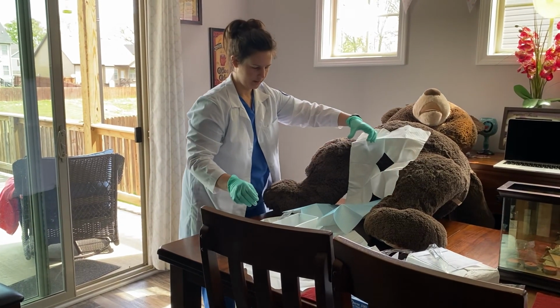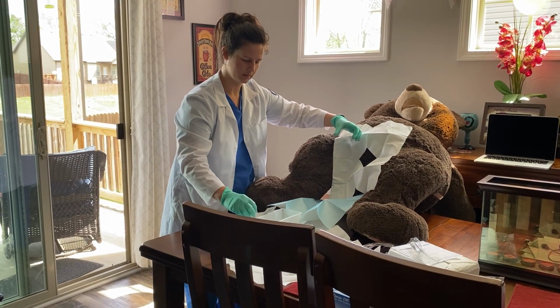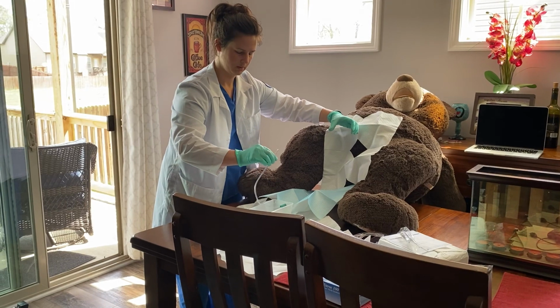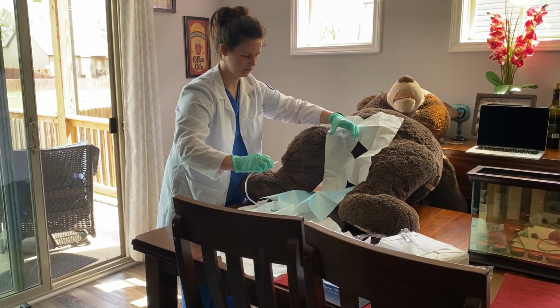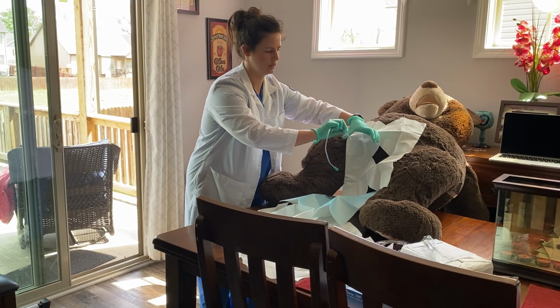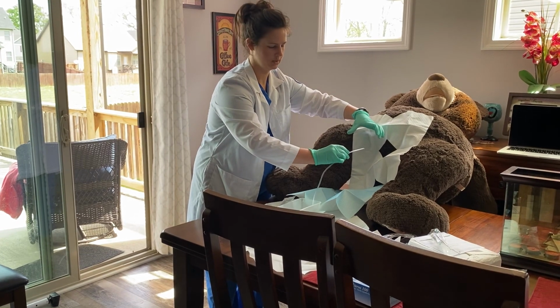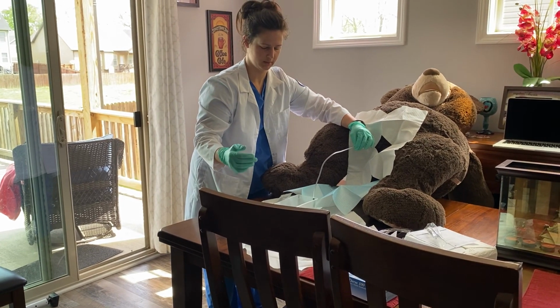And then what we would have done was set the catheter inside the lubricant, and I'm going to pretend that it was open and it's lubricated, keeping the penis steady with your non-dominant hand. You want to take the lubricated catheter, and there's a lock if you want to use it on here. You want to have them bear down as if they're going to pee, and you want to push in. And on males, since they have a longer urethra, you're going to go down about 7 to 9 inches, but basically once you see the urine coming out, you want to go 1 to 2 more inches, and then you want to anchor it with that non-dominant hand, because it's sterile, so that it does not come loose.